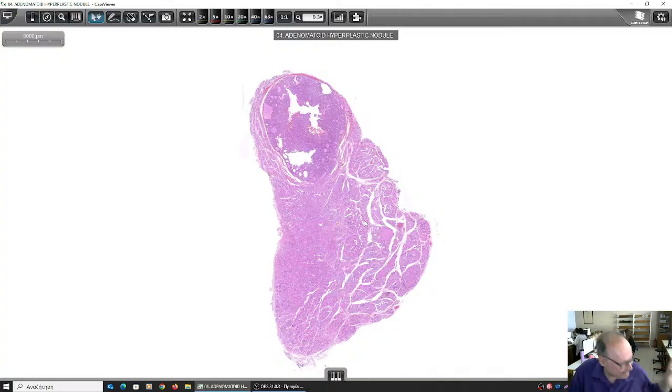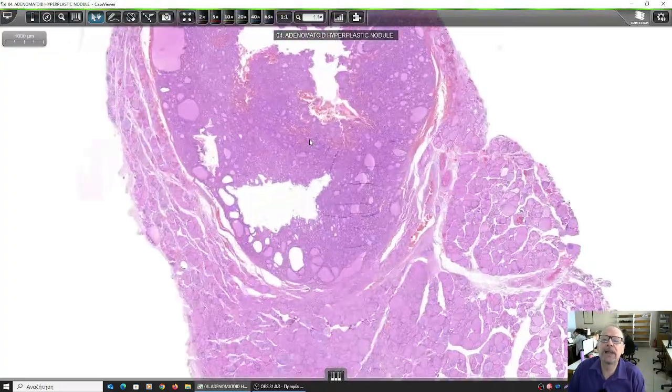It's not necessarily a sign of malignancy. However, we should check it, and we have an FNA, a fine needle aspiration biopsy, to check single nodules, because when we have many nodules, like the first slide we saw in the endocrine gland pathology, the nodular hyperplasia, when we have many nodules, the possibility of cancer is minimal. The possibility raises when we have a single nodule. And let's have a look at the cells.